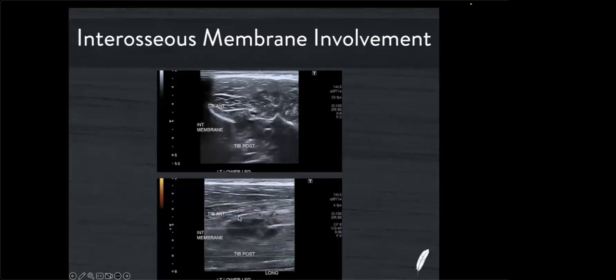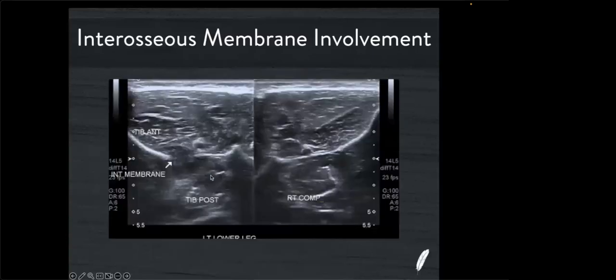And in the long axis, you can see this rather large hematoma, and you go from a very strong line here of the interosseous membrane to a very weak line here, which is almost certainly just being produced by some partial voluming from the beam width. These are just more images to show exactly the same thing.